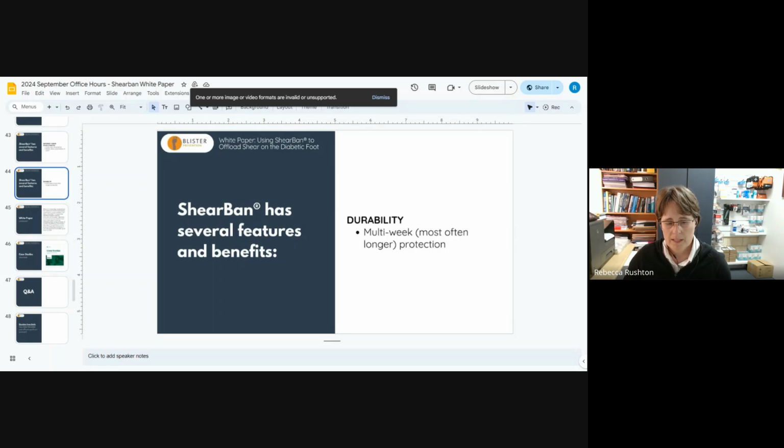Another application that I use it for is painful calluses, and I'm thinking mainly of people with adult acquired flat foot deformity and painful calluses, and even blisters under the callus at the medial first MPJ and sometimes the hallux as well. One lady comes to mind because she comes from Perth to the holiday down here, and she sees me for this in particular.